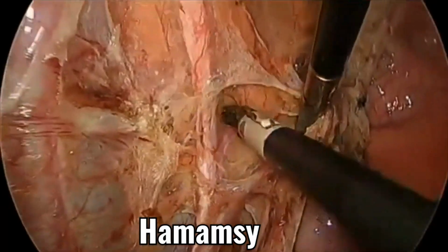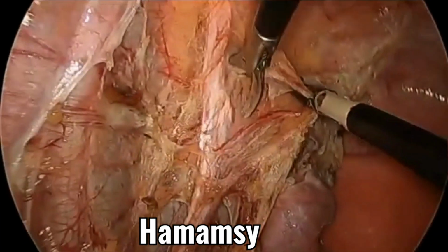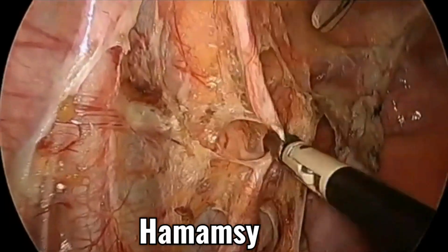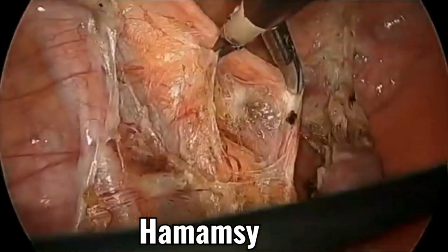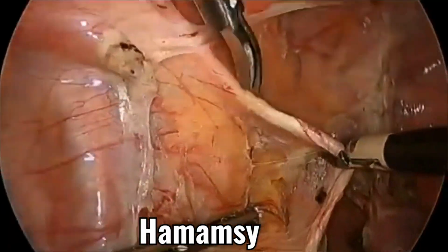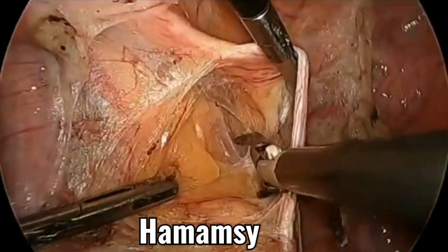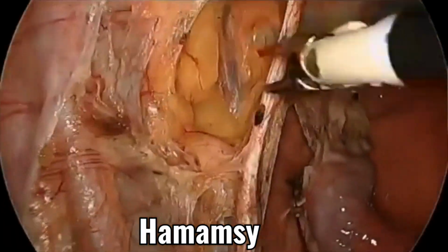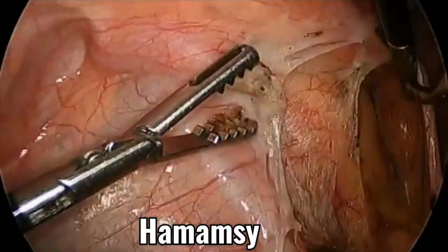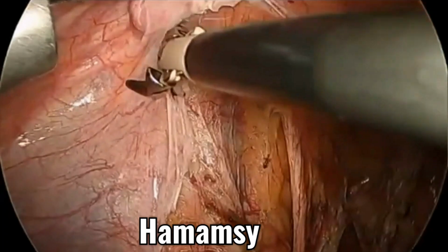Dissection of peritoneum along the iliac vessels, as you can see. اهو. طبعا الباوندرز from above downward very important. تمام. يبقى تاني dissection of lymphadenectomy: you must go from lateral to medial in block, not in pieces.